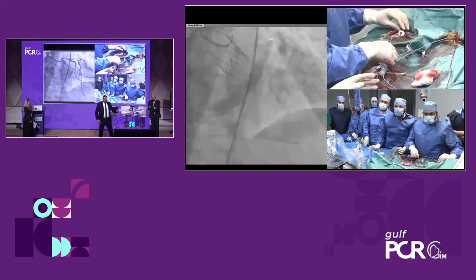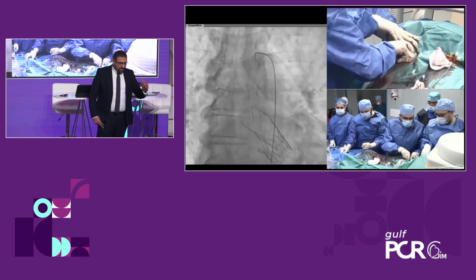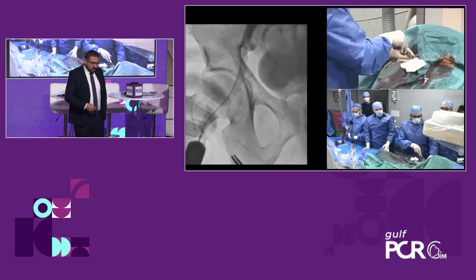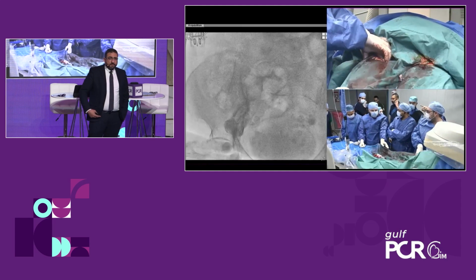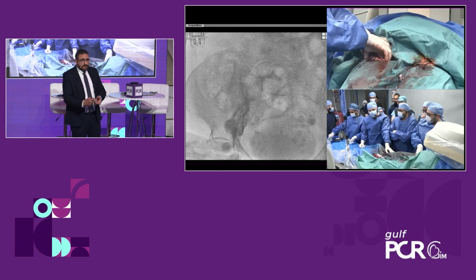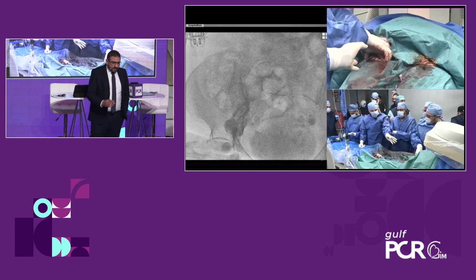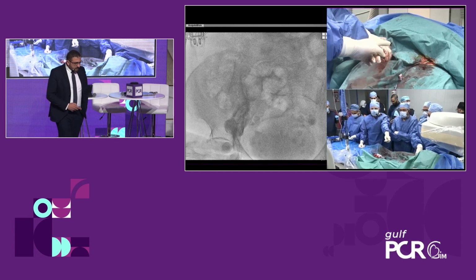I wanted to illustrate how easily you can access the coronaries after valve deployment. And it was very straightforward cannulation of the left main. And as any straightforward post-TAVI, you just go and close the ProGlide. I like to take from the similar site, I advance a 6 French dilator, and I take an injection after closing the ProGlide, just to make sure that I don't have any vascular complication, dissection or extravasation, and so on. Then I give protamine and then some compression, and that's it. So that was our case.